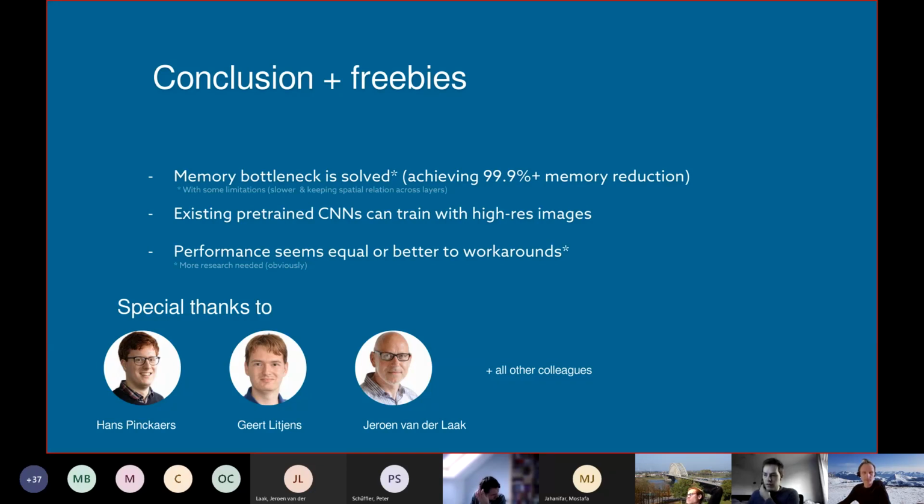Again, it might not be the most efficient way of tackling it, but for our purposes it still worked really well. Then you get another, I think, 8 or 16 times downsampling, and of course it quickly adds up. What we're left with, in the case of an input of 65K, after the encoder, the ResNet, are feature maps that are 2K by 2K in terms of their spatial size. And after the max pooling, they are only 256 on either side with 512 channels.